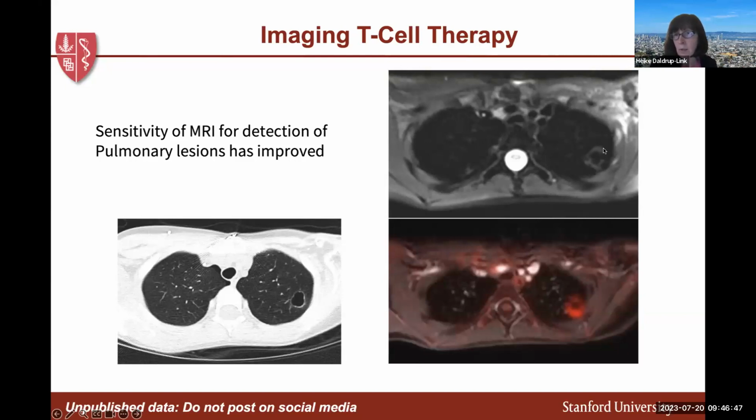We don't know exactly what that is. Is that a cell infiltration or is that edema? But either way, we actually see these cavitating nodules usually quite well. And this rim also is often metabolically active. So it's important to know that we can detect these lesions quite well. And if you see this in a previously solid nodule, it's often a sign of response to the treatment.